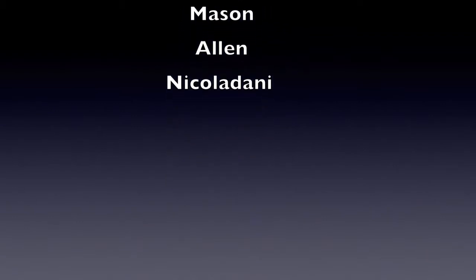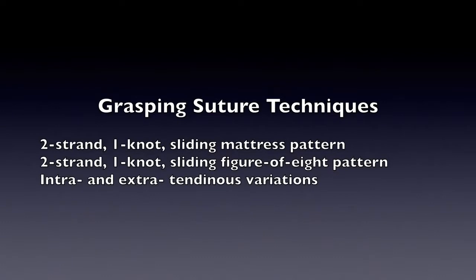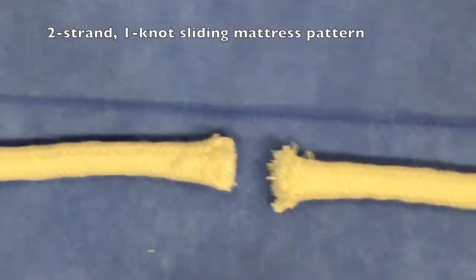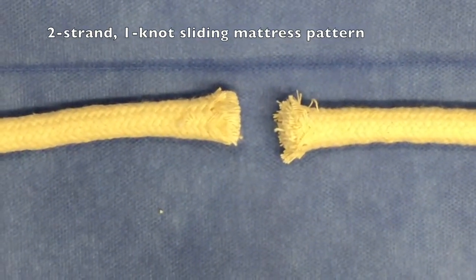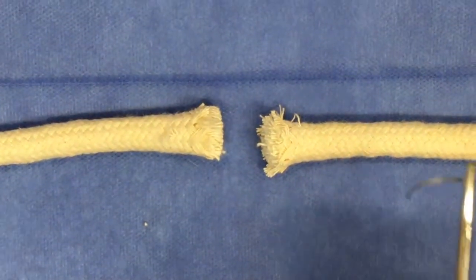And a lot of problems and confusion can arise when eponyms are used to describe surgical procedures. So what I'll do here instead is use descriptive terms to describe some technical procedures which may be of value to you in the ER when performing extensor tendon repair. We'll start with the 2-strand, 1-knot sliding mattress suture pattern. I like this one because it uses a pattern familiar to the average emergency physician, which is the horizontal mattress suture pattern. So here's how it goes.